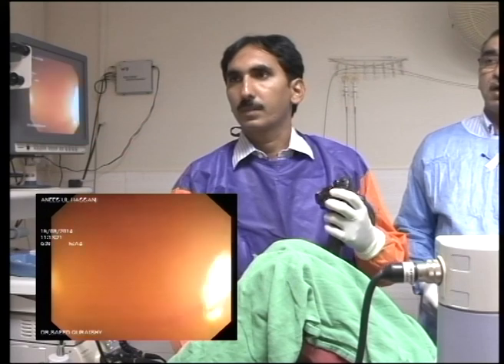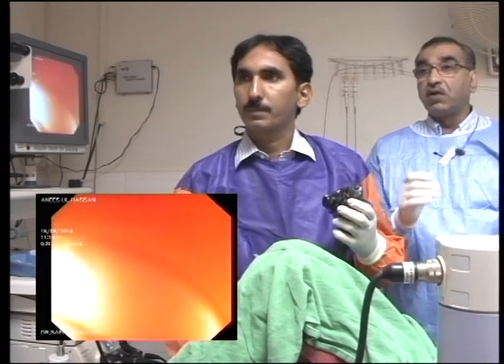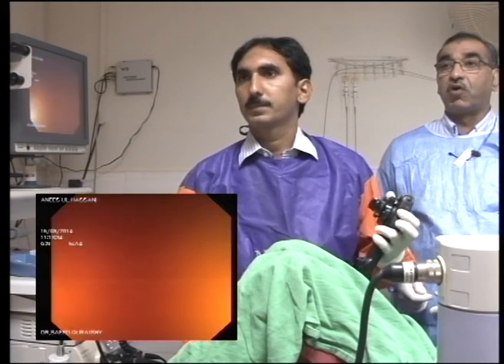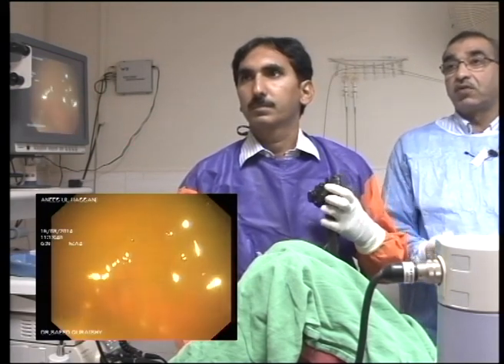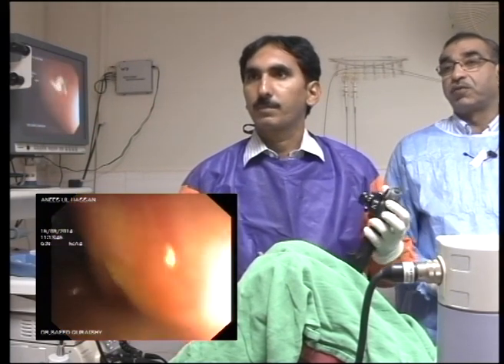Okay, yes. Now in this situation you can't do anything, because you can't see anything, right? So what you can do is withdraw your scope a bit. Whenever you're in endoscopy, the golden rule is if you can't see, withdraw and give it a bit of torque, because your lumen is at the 1 o'clock position. Give it more torque, clockwise torque. You lost your position now.